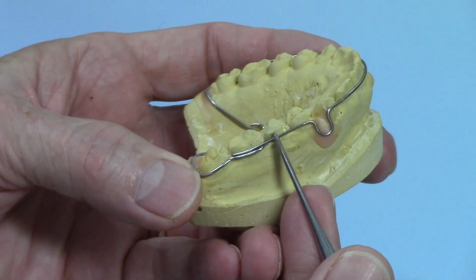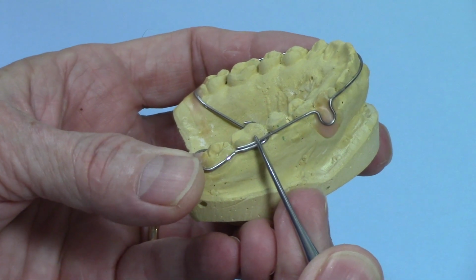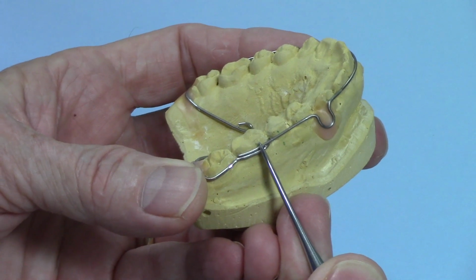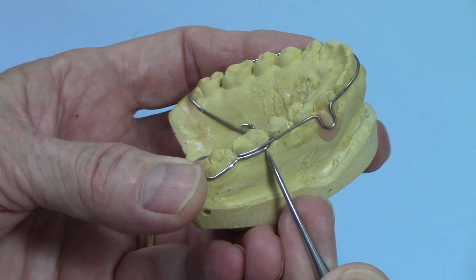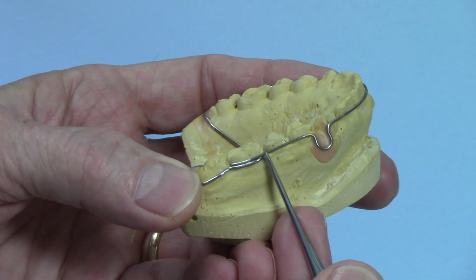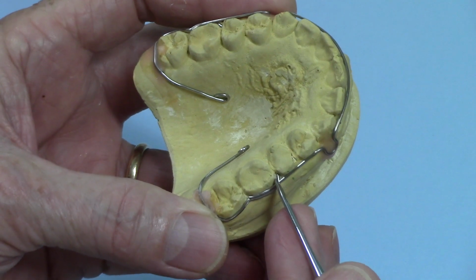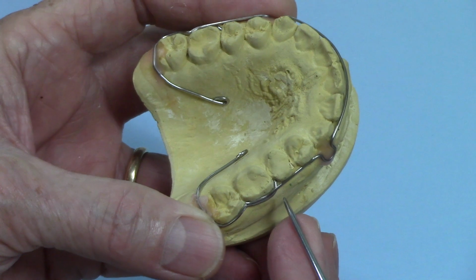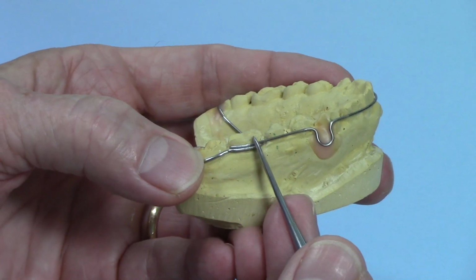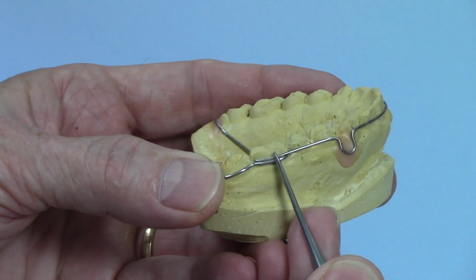Now, I want to have this 036 wire to be free as much as possible for adjustability. So I'm going to put my heat protective compound before I solder it, up to like the border of the middle third and the mesial third of the molar, right about there. So that way I have all of this free to be adjusted. If I didn't do that, say I would just put it up here, well, solder would run up here and there would be just a little stub of a piece of 036 sticking in there, and it'd probably be all right, but it just doesn't allow for much adjustability. So I'm going to have the heat protective compound up to here, so it'll stop the solder.